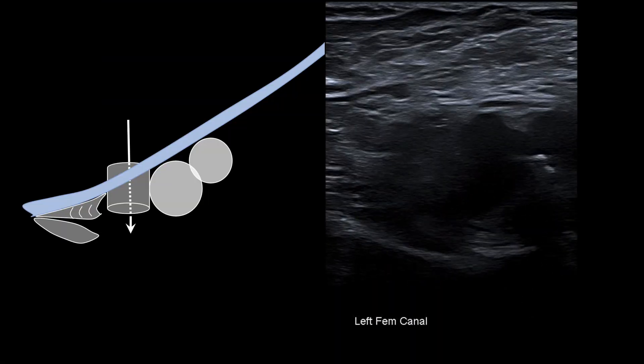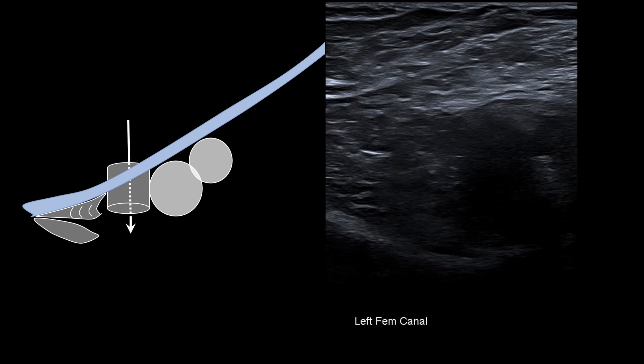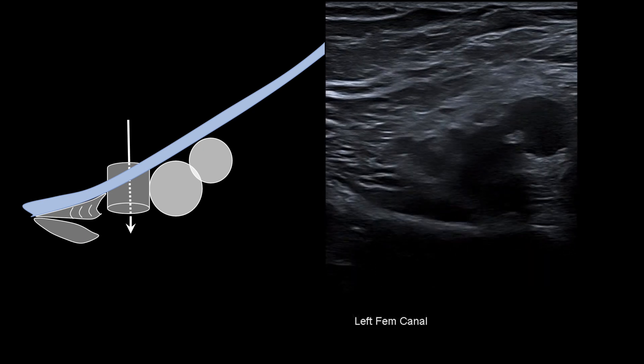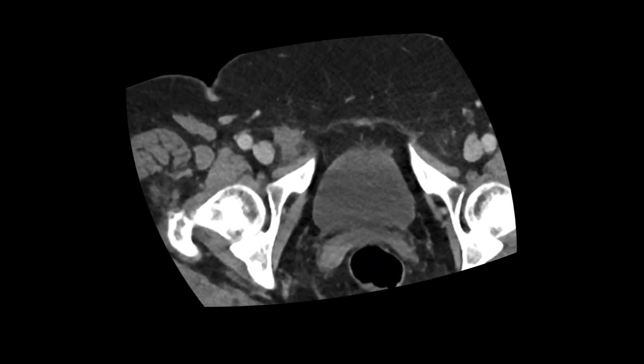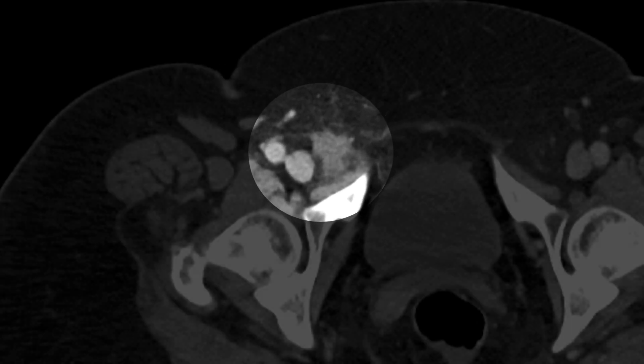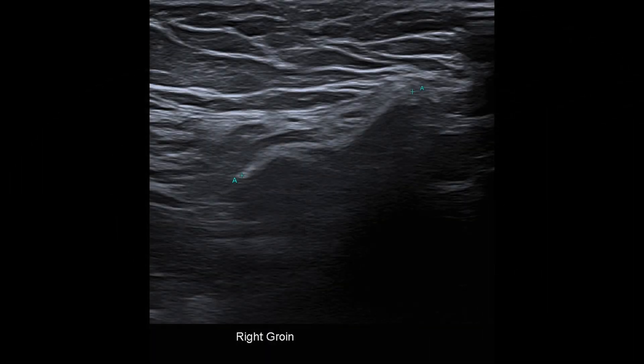The management of femoral hernias can be slightly different. This is a CT that reported a nodular soft tissue density within the right groin, query atypical lymph node. But on ultrasound, we can see a linear echogenic line with some minor shadowing, consistent with a proline hernia repair plug.